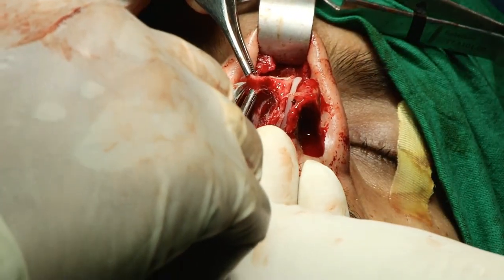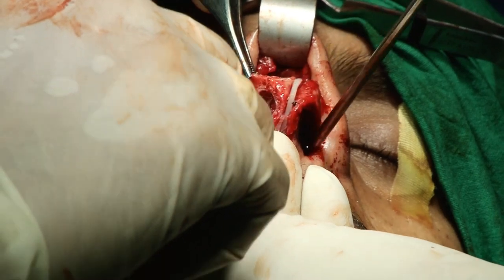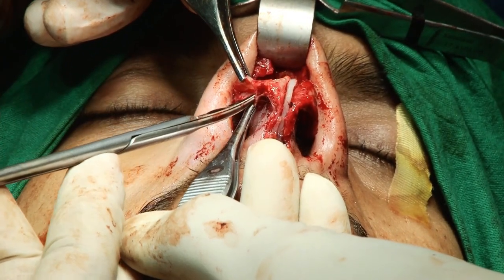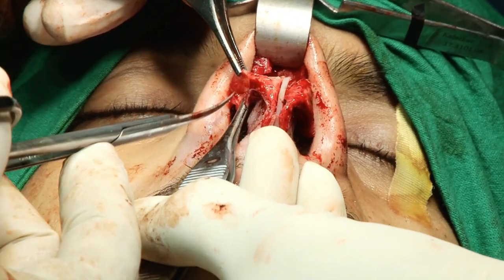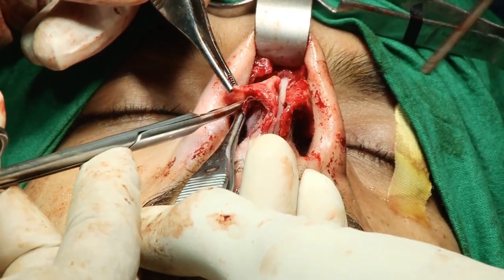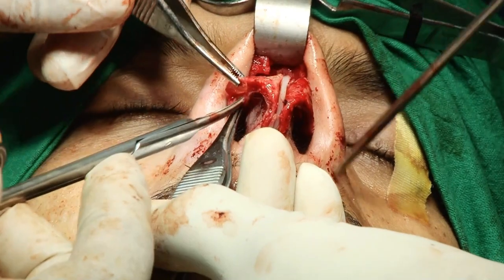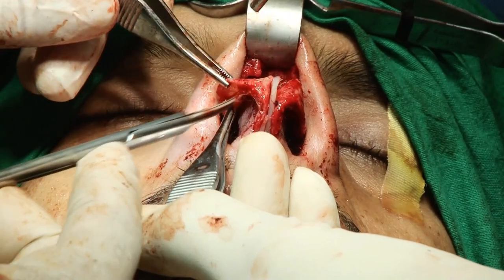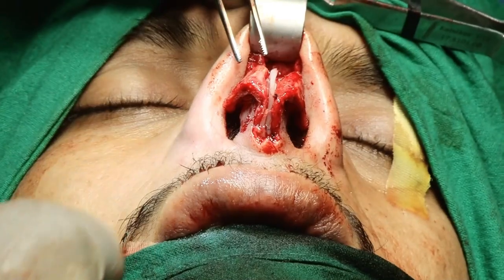Sometimes when you want to separate this, you have a problem. So for my beginner friends, you can use hydrodissection by infiltration of the vestibular skin. When you have a diffuse depression, classically you use the lateral crura flip. But in this case there is no need. We just put a cartilage block on the underside, with a number 15 blade. Marking there, marking. So we have to do it.